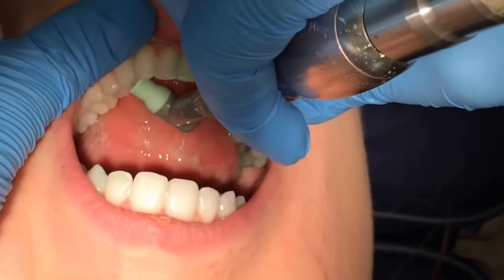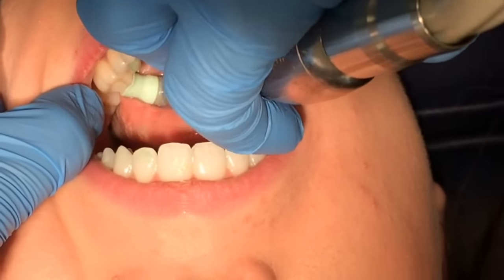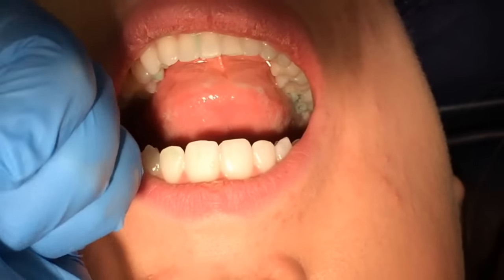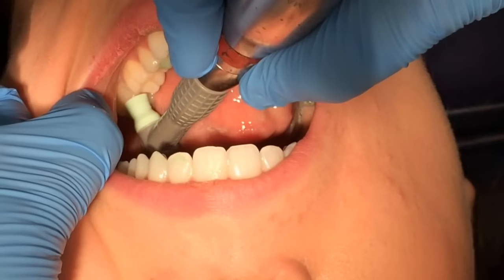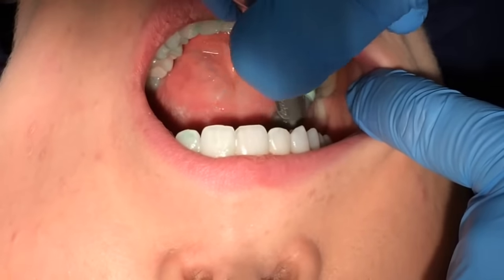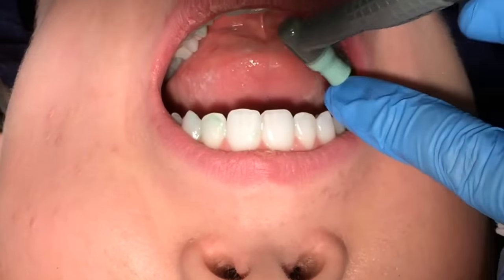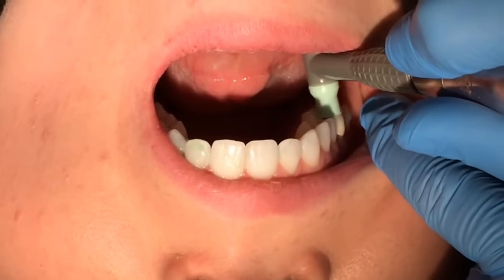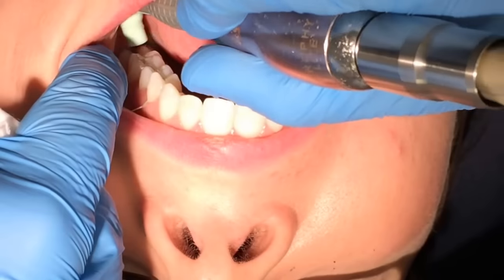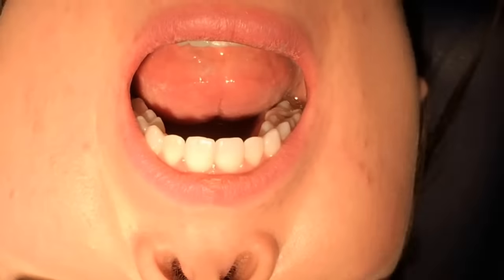I feel like if you do a really good job with your scaling, you don't have to do a ton of marginal polishing as you remove that biofilm and you're done with your instruments. Don't forget the occlusals — they don't get any action with the instruments. And done.